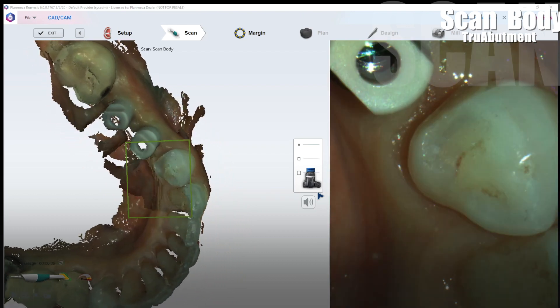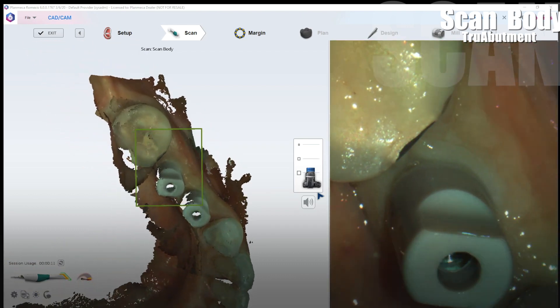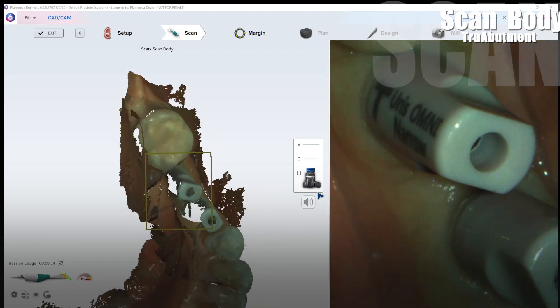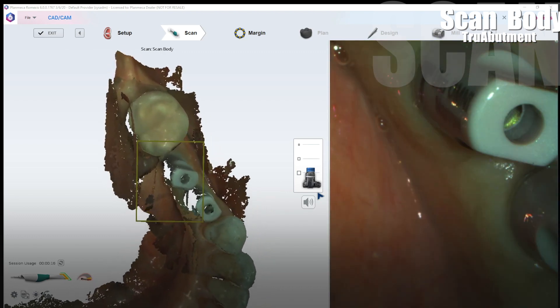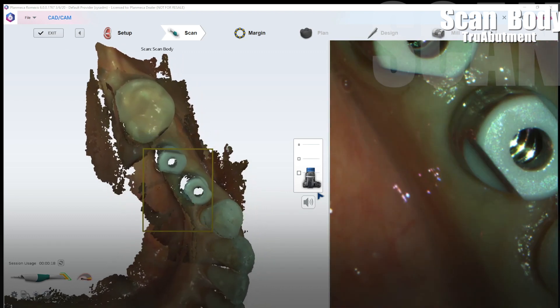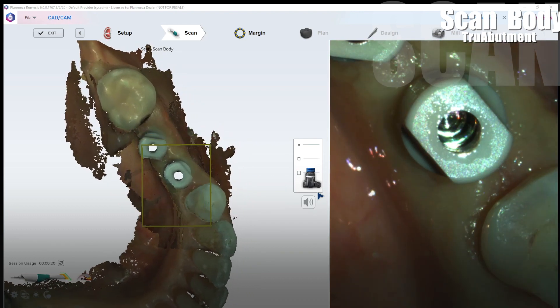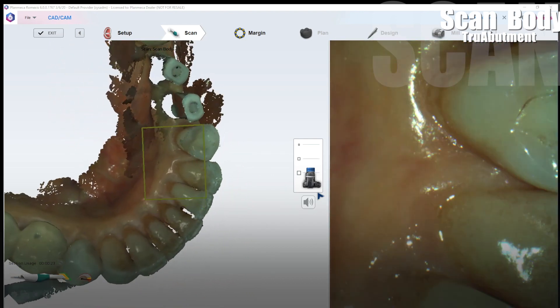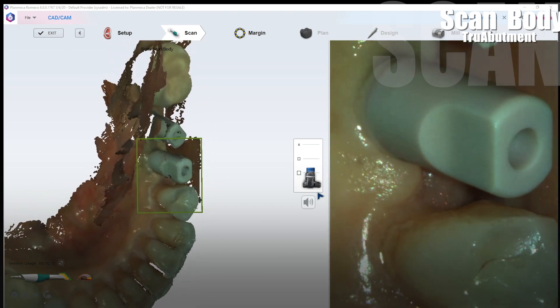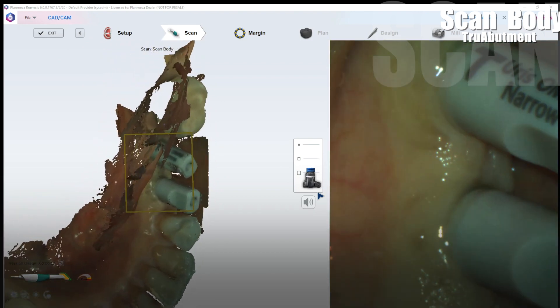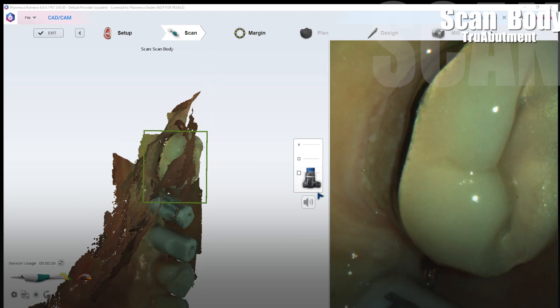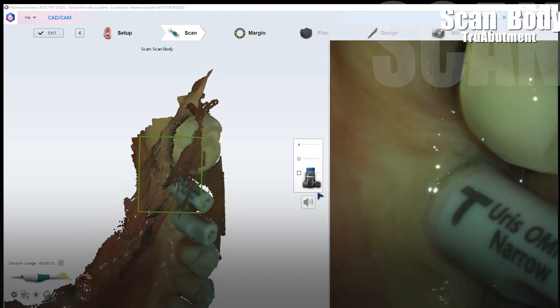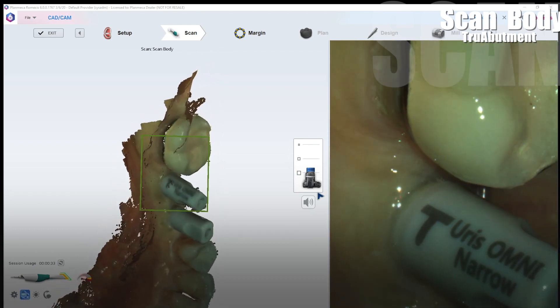Notice how I started scanning on the facial where the scan bodies connect to the tissue. The reason why I do this is to avoid automatic delete of the scan bodies using the artificial intelligence algorithm of the active delete, which might confuse it with a tongue or a cheek if it's not connected to the actual tissue like that.